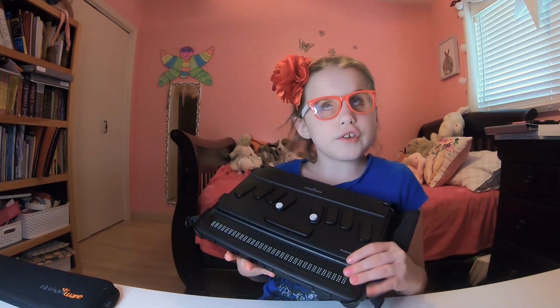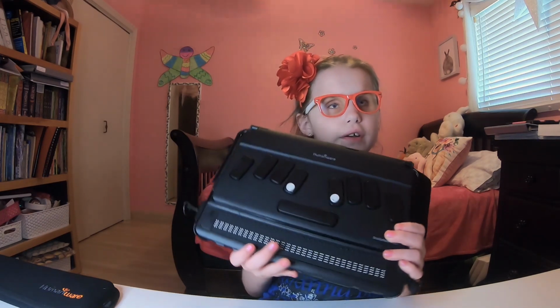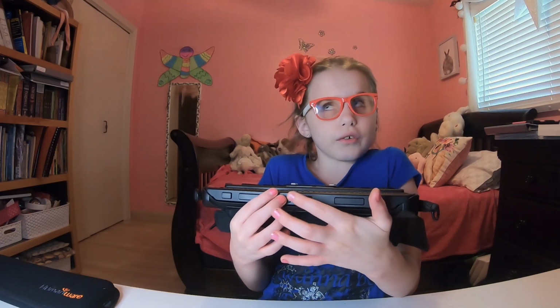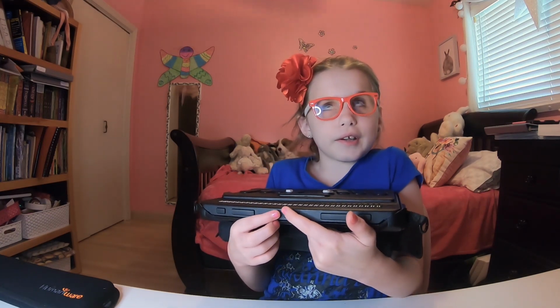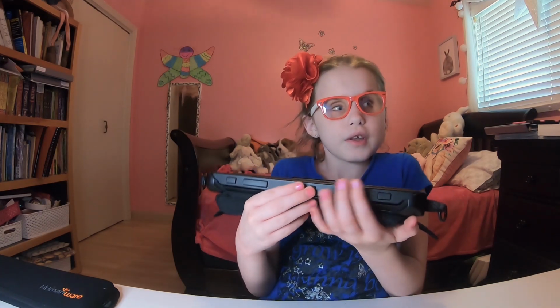This is a 32 cell BrailleNote Touch. I think you can only get it in 32 cells. You have your little buttons here: a triangle, a circle, a square. Again, that is in another video. I don't know if we can add three links, but we'll try to. There's also going to be a link to that video because it's an introduction to the BrailleNote Touch, and I explained a bit more about the buttons, but I'm just going to go through it in a bit.